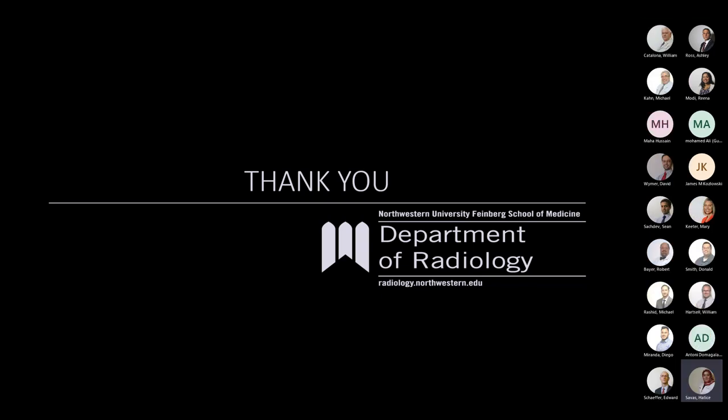Dr. Hussein and Dr. Hart, I think you can just jump into the discussion. Sure, maybe I can go. Hatice, you've done a fantastic job, and there's a lot for us to learn. The critical part from my perspective is to be more cautious about the overall picture rather than just a believer, because you and I have shared several cases where a PSMA rib abnormality changed over time. Another patient we biopsied turned out to have multiple myeloma.